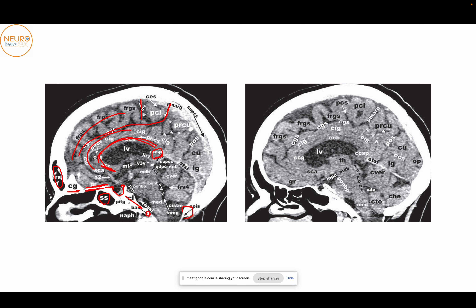You can also see the cingulate gyrus, above which forms the cingulate sulcus. The cingulate sulcus ends posteriorly in the marginal sulcus. There is also a paracentral sulcus, which along with the marginal sulcus demarcates the paracentral lobule. Behind the marginal sulcus you have the precuneus, behind which you have the parieto-occipital sulcus, and below which you have the cuneus. You can make out the tentorium as a hypodense structure separating the supratentorial and infratentorial space — it is hypodense here because the straight sinus runs through it. Below this is the posterior fossa with the cerebellum, the superior medullary velum, inferior medullary velum, fourth ventricle, and the quadrigeminal cistern. The vein of Galen comes from the internal cerebral vein and drains into the straight sinus. This is the midbrain, pons, and medulla, and you can also make out the tectum posteriorly.